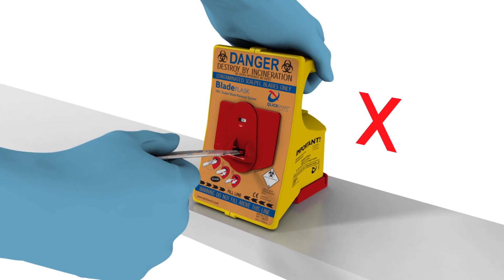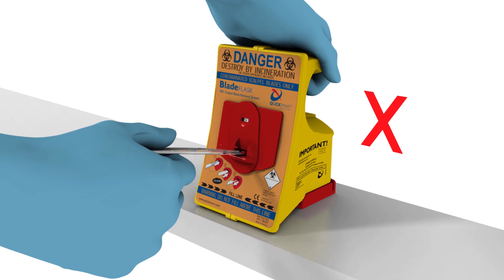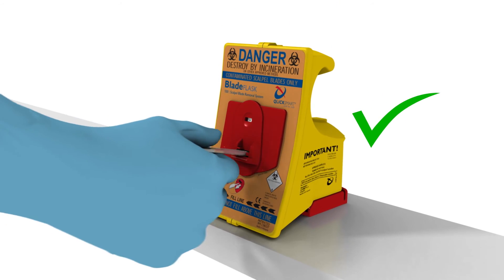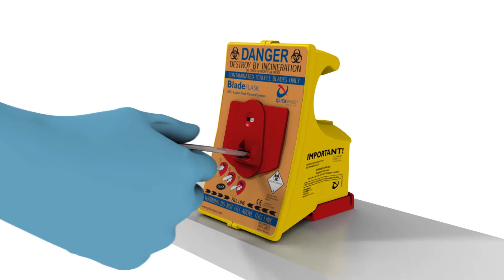Use one hand only when removing the blades. Because the ClickSmart Blade Flask is securely fastened onto the bracket, no further support is required.